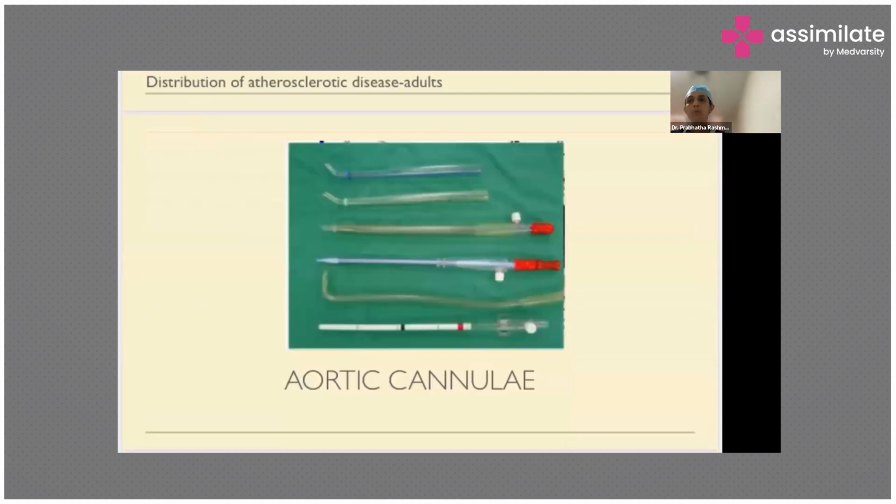So those of you who are perfusionists in the audience are very familiar with this. For the rest of you, these are the choices of aortic cannulae that we have. These are the cannula which we put into the patient's aorta. And as you can see, it comes in various sizes. So the size is dictated by the size of the patient and the flows that are required.